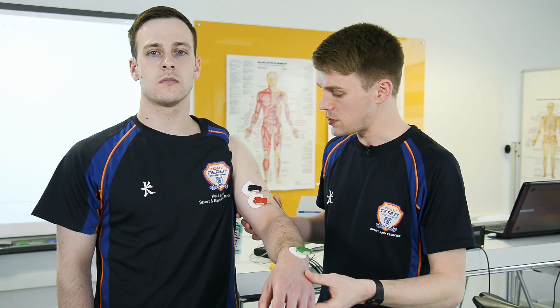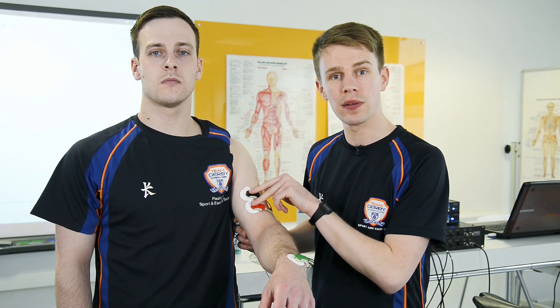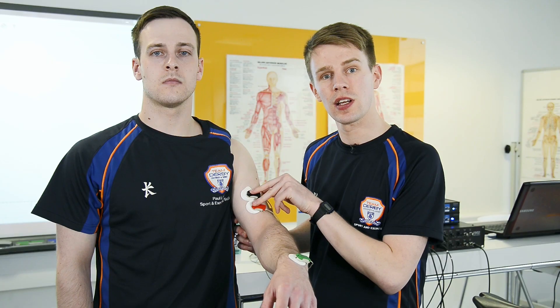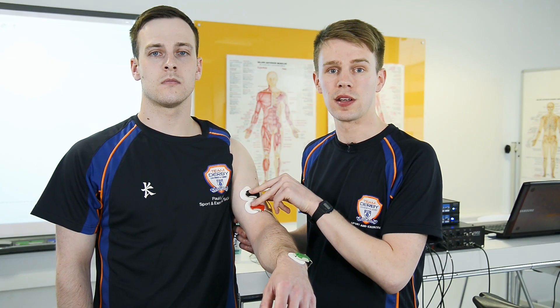Therefore, by taking the differential — that is, by subtracting what I hear from what Paul hears — we'll be able to eliminate these common sources of sound. This can also be applied to EMG. As electrical noise is simultaneously picked up by both electrodes, it can be cancelled by looking at the differential.